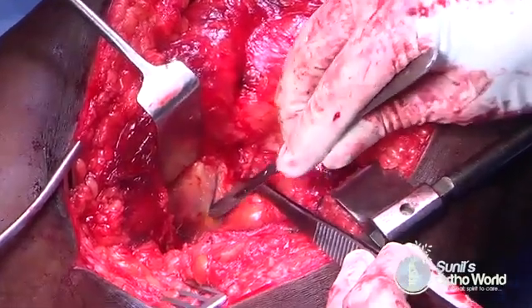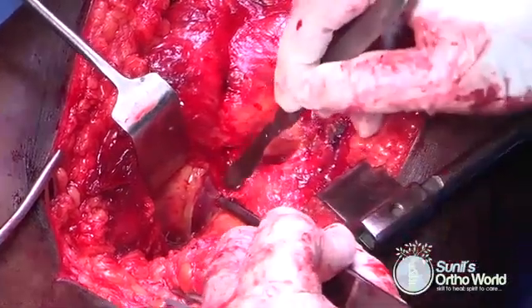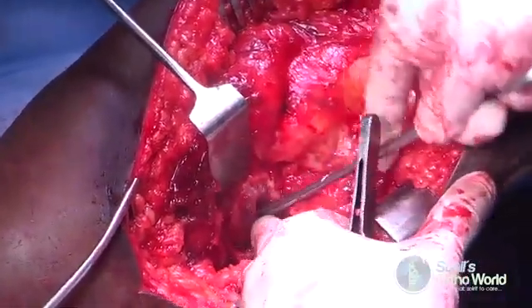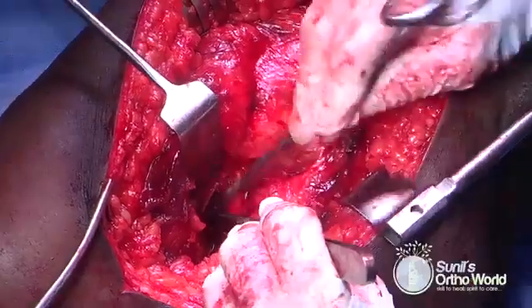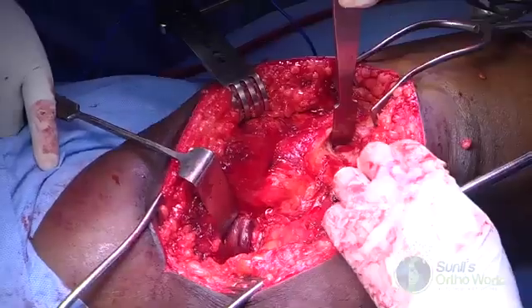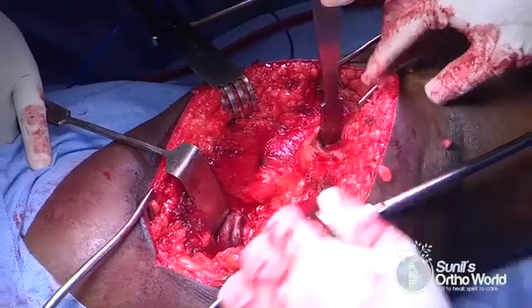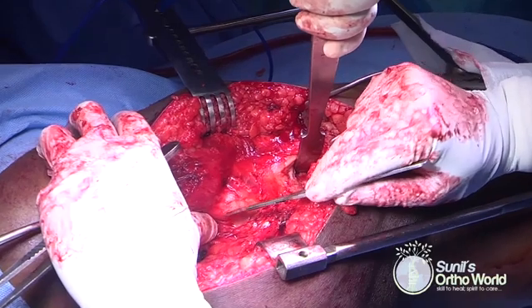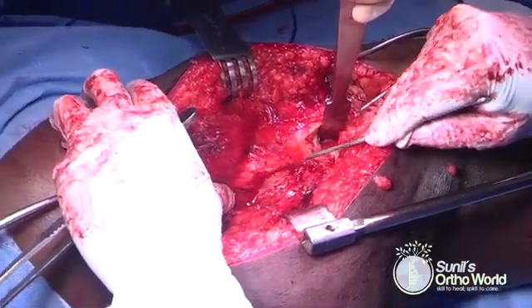The space between the gluteus minimus muscle and the piriformis tendon is developed, and the gluteus minimus is gently elevated from the underlying capsule to make anterior exposure much easier. At this point, all the important posterior structures have been identified. The vastus lateralis muscle is then elevated off the femoral shaft for a distance of around 5 to 6 cm, and the osteotomy line is marked with a surgical knife.